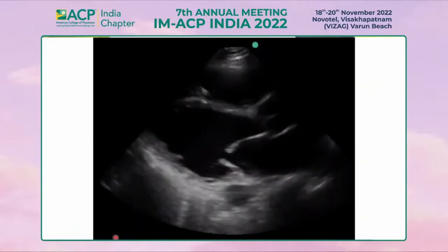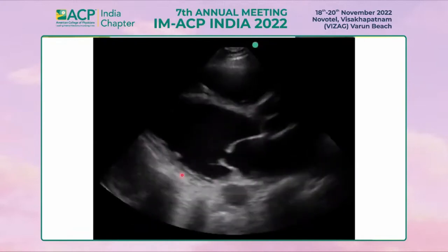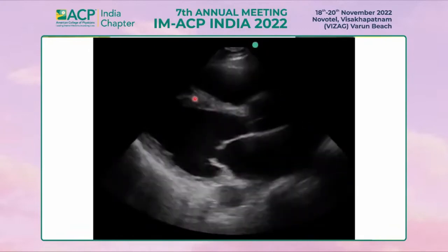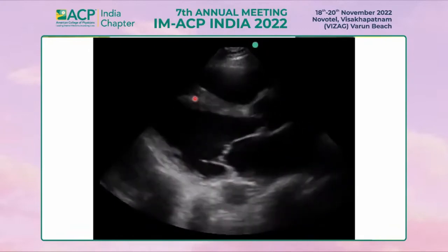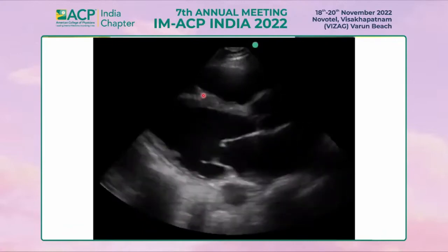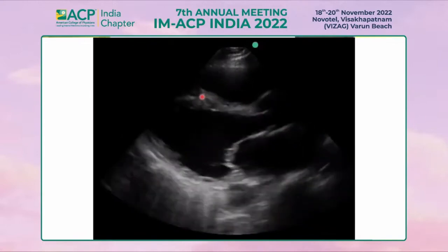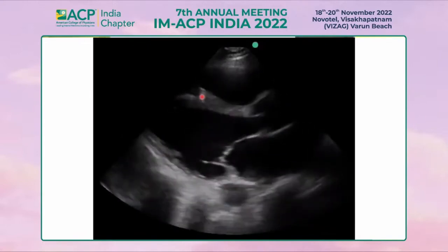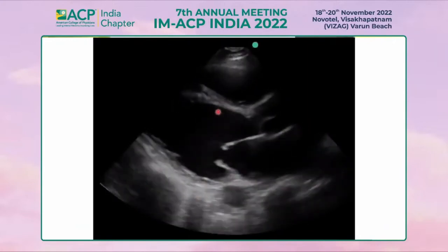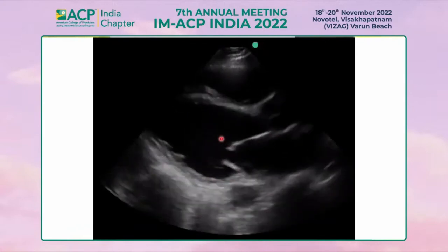How about this case? First, endocardial excursion, negative. Second, myocardial thickening over 40%, negative. Third, the anterior leaflet of the mitral valve does not get closer to the septum, until less than 1 cm. So this case is severely reduced.